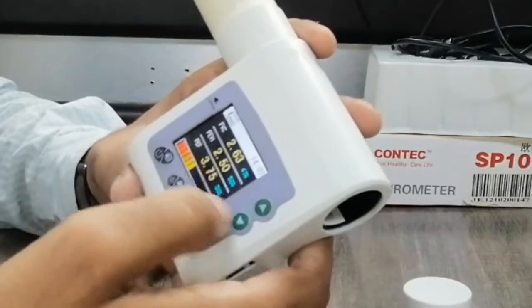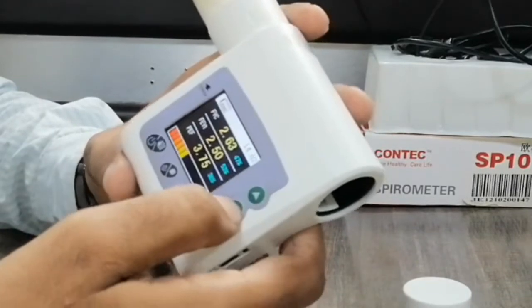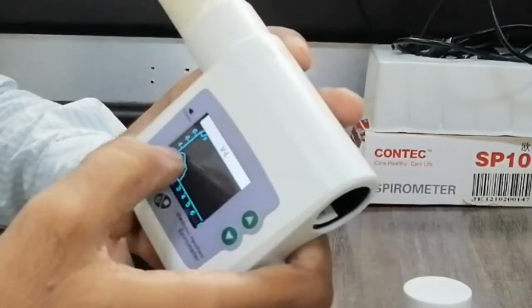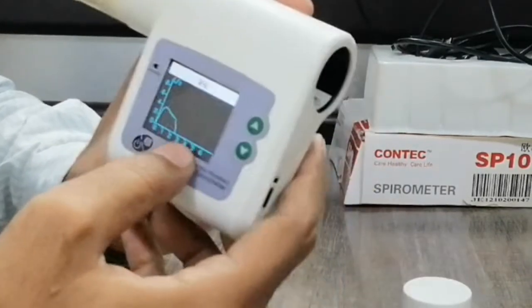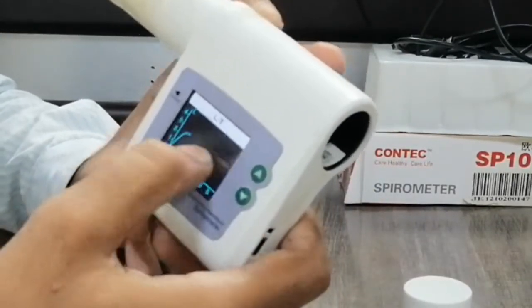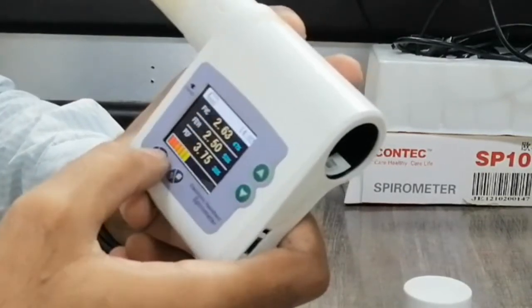The values 47 and 43 reflect my breath strength. I can press this to start the breath test — you breathe into the mouthpiece and the device records the result as a graph showing the same parameters.